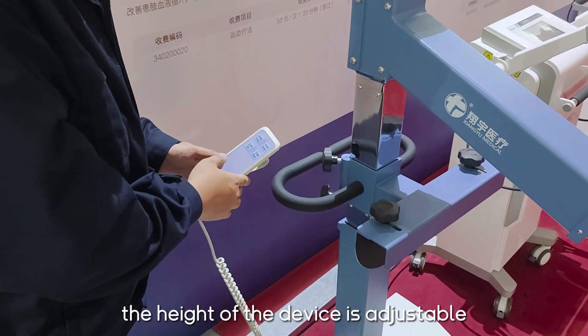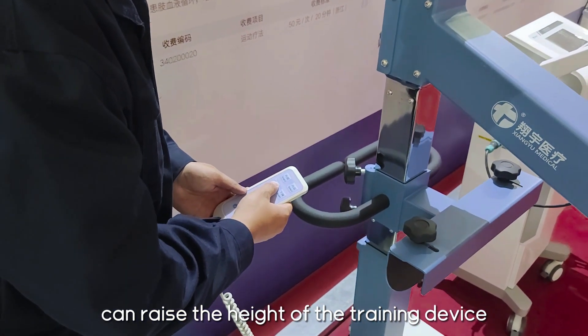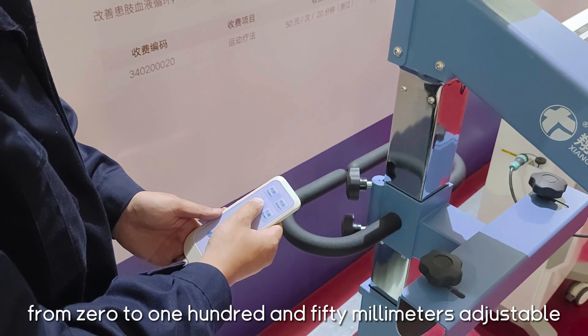This is the control handle. The height of the device is adjustable. Press the UP key of the control handle to change the height of the training device. The height adjustment pole is adjustable from 0 to 150 mm.